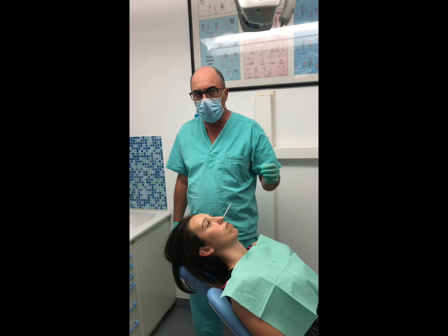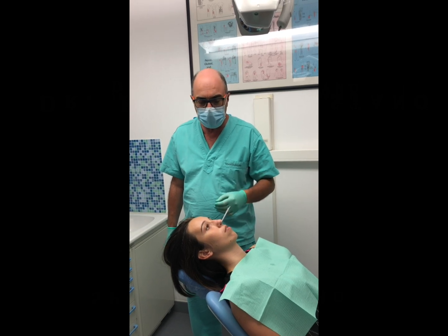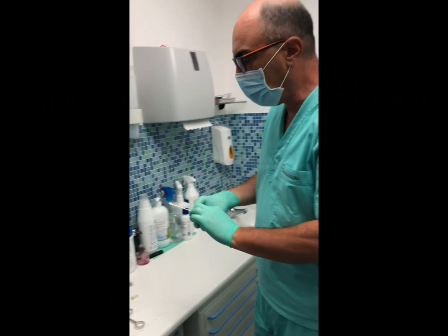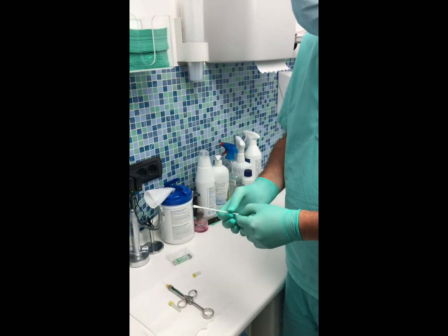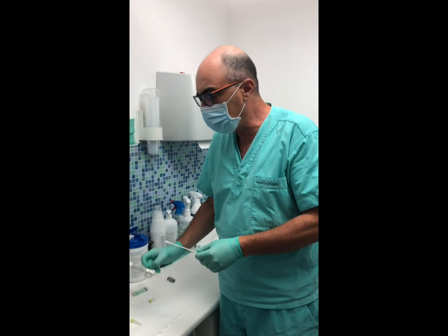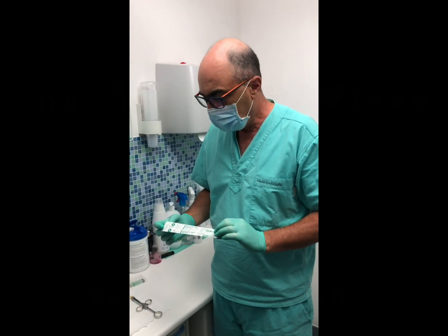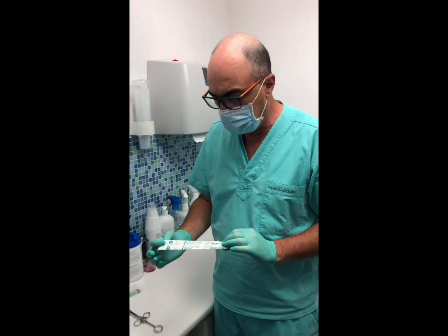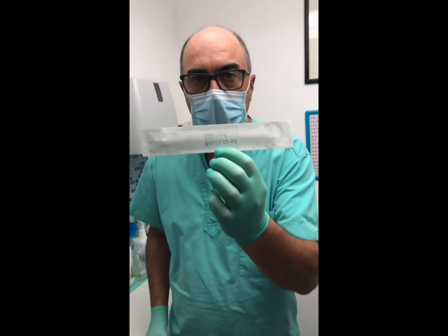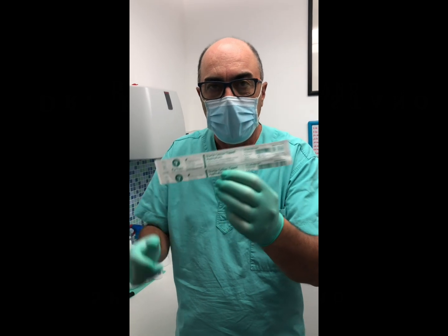I'm going to show you how to perform SPG blocks. Come over to my course — I'll be happy to teach you directly, it's quite simple. What we're doing here is we are using Lidocaine solution to perform SPG blocks. We're using these special stair applicators — let me show you their code right here. I hope you're able to find them; they're very difficult to find in Europe. They're made by Puritan.